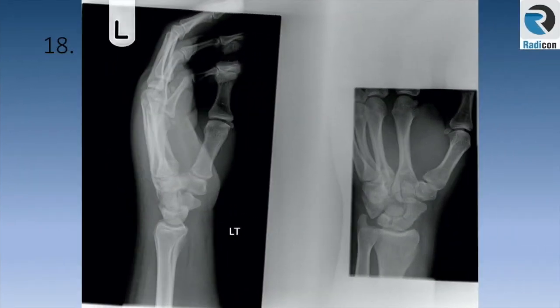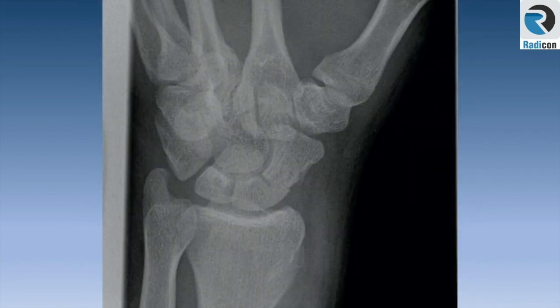Case 18 is a lateral and scaphoid view of the wrist. Let's zoom it up — an easy to spot scaphoid fracture. It is worth remembering that in the real exam and real life, more than 80% of abnormalities are easy to spot as long as you follow a checklist and review areas one by one.